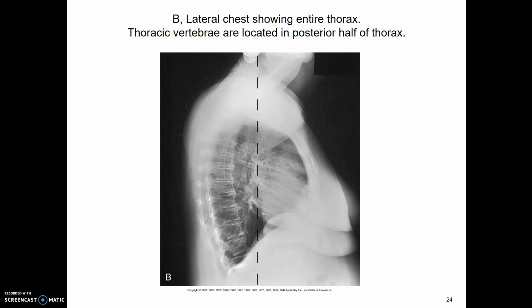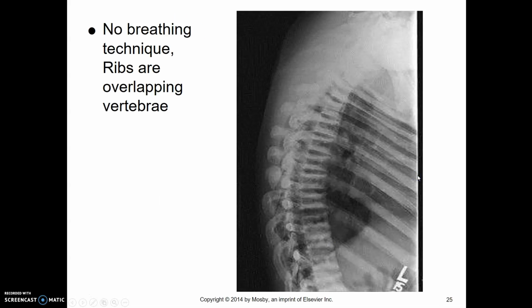Something important to remember is that the thoracic vertebrae is located posterior, so please don't let me see your T-spine look like this. This is supposed to be a chest x-ray. But just remember your T-spine is posterior, so you're going to come back a little bit from midline. Lumbar spine, we don't come back as far, but T-spine really makes this curve. Also, try not to collimate too tight. If it is this rounded one, especially if they're kyphotic, don't go too crazy.